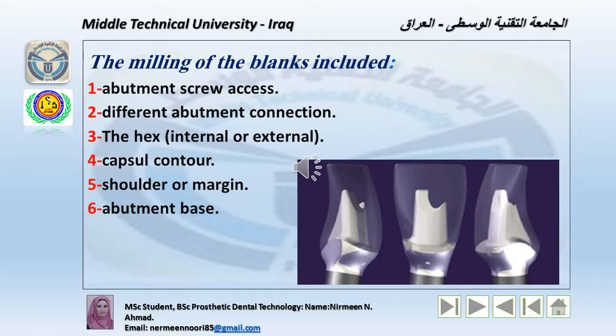Also, the blank used for milling the abutment should include the abutment's connection to accommodate many different implant systems: the hex, either internal or external, the emergence profile contour and the occlusal morphology, the shoulder or chamfer margin, and the abutment base, which was shaped to maximize the ideal tooth preparation from the gingival excess.